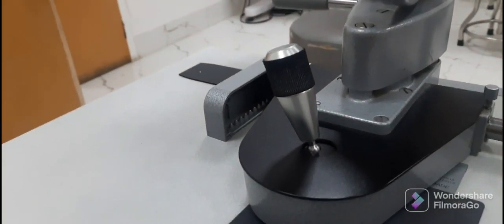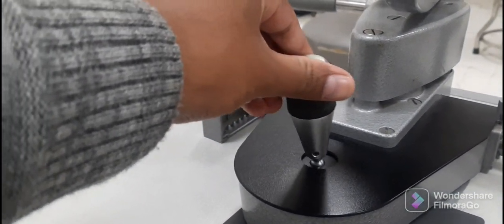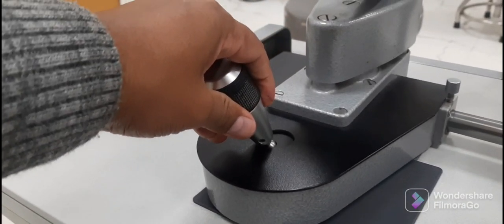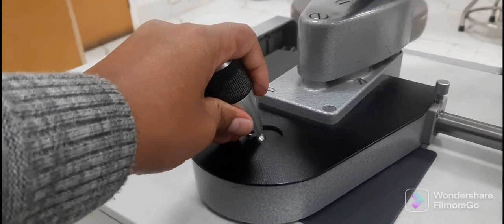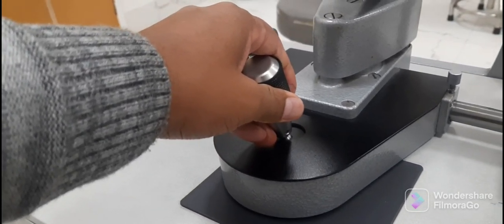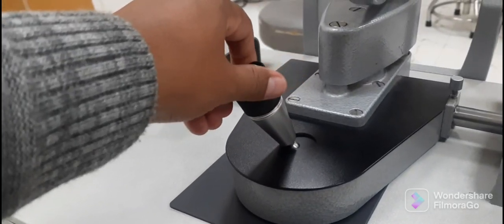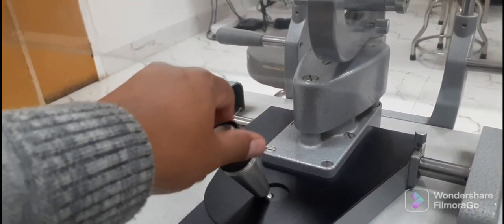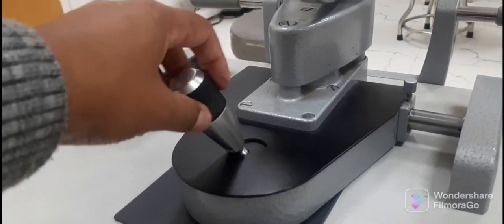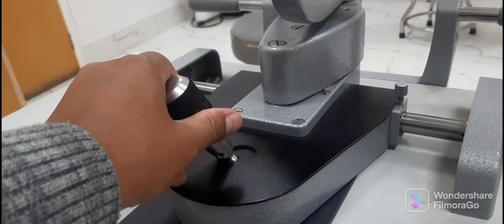This is the joystick, used to move the slit lamp in various directions according to the adjustment needed for the patient. By using the joystick, the slit lamp can be moved backward, forward, left, and right. By rotating the joystick in a clockwise direction, the slit lamp moves upward, and anticlockwise, it moves downward.